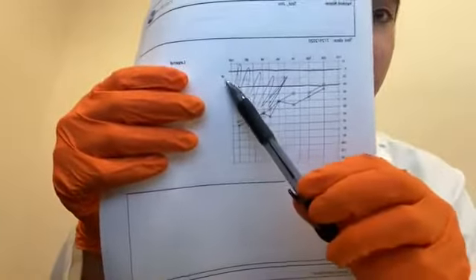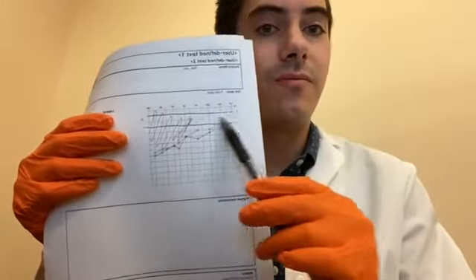The next steps going forward: we're going to be fitting you with some hearing aids based on this audiogram. We're not going to blast them up all the way — that's going to be way too loud. We slowly work up to your prescription level so that you can comfortably adjust to hearing a whole new way, because it really is a whole new way of hearing. You'll be working with me, or Carolyn, or Thomas, or any of the other specialists here. You'll come to see us for check-ups, tell us what the problem is, and we make adjustments. This line up here at zero is what's considered standard normal hearing — maybe when you were 18 years old. We have to have expectations; it's never going to be exactly like it was when you were a teenager, but our goal is to get you as close to that as we can.